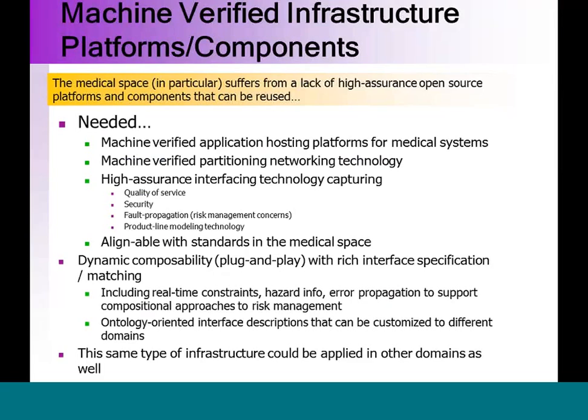For example, Cerner is a large medical informatics company, and their system runs on top of JMS, which is another messaging system like DDS. It was a predecessor to DDS. But they have large-scale servers that support an entire hospital with failover capabilities. If one server goes down, you automatically fail over to the other one, and so forth. That's one of the reasons we wanted to allow flexibility in the standard. So if you come up with different architectures to address this scalability problem, there are principles in place for how to move forward.